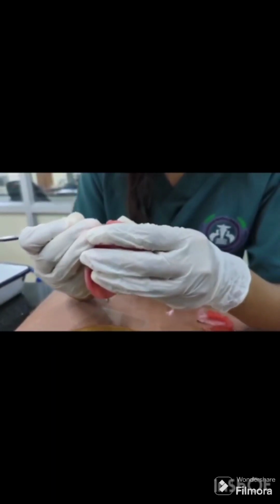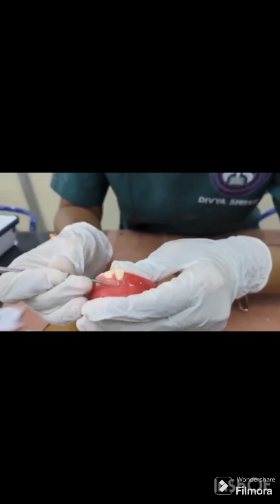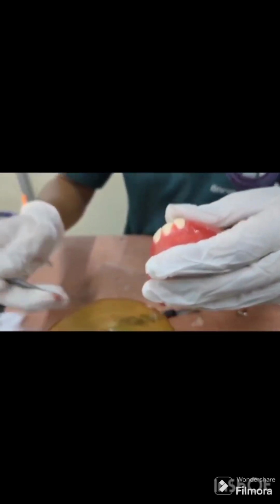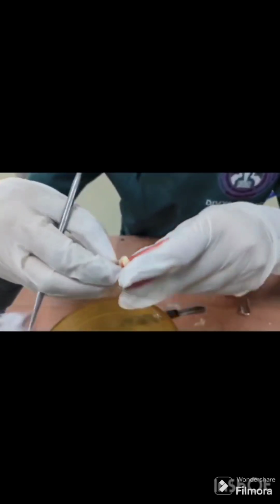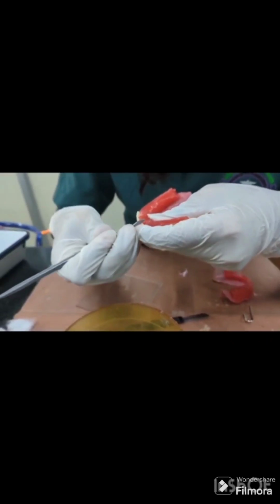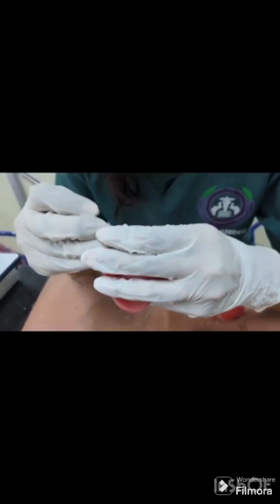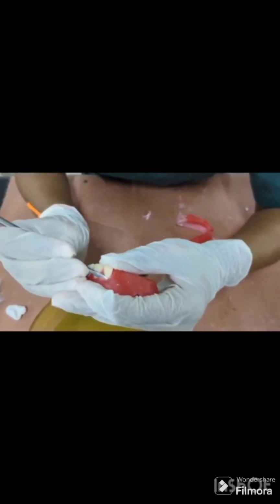Next, arrangement of the maxillary lateral incisor. Its long axis slopes more towards the midline. When compared to the central incisor, the incisal edge is about 1 mm short of the occlusal plane. A mesiolabial rotation usually looks good in a delicate patient and is called a soft lateral.